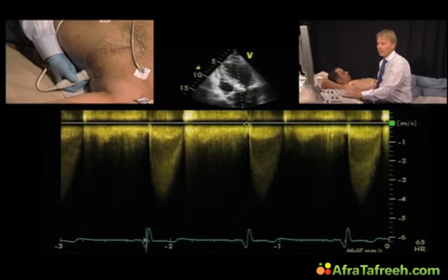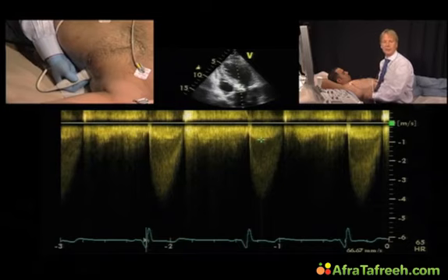Also very important to see that you get the LVOT within the curve. First of all, this gives you information if you really have the signal of the aortic valve, and second of all, it's usually a sign that you are in an optimal position with your Doppler spectrum. In the next demo, let's look at what we can actually do with the acquired tracing of the Doppler spectrum and what information that can give us for the quantification of the severity of aortic stenosis.